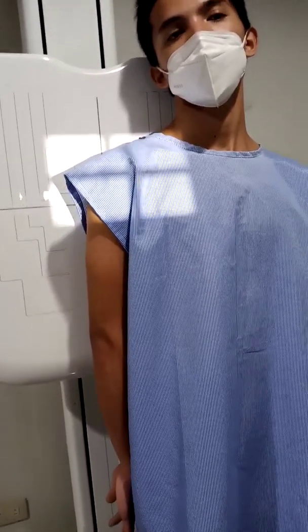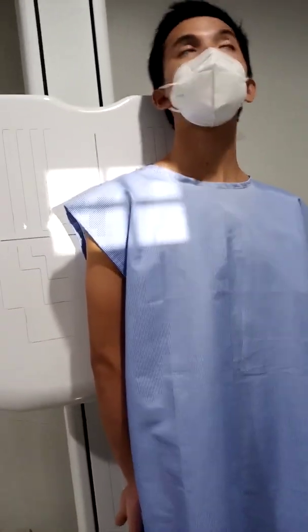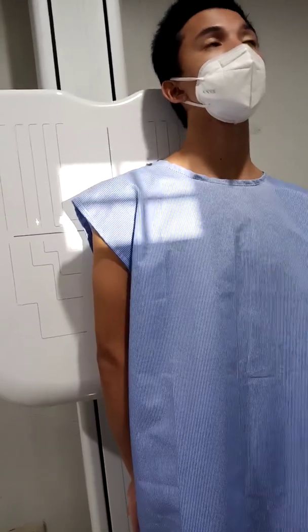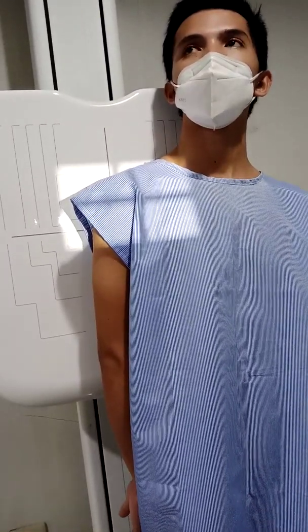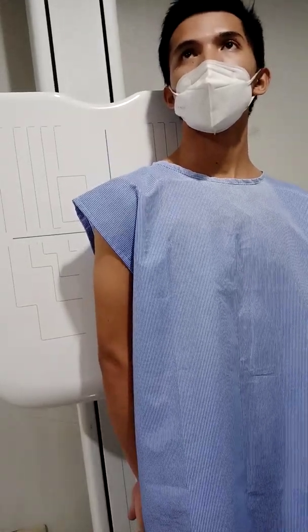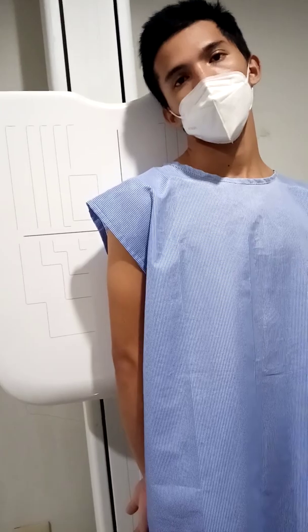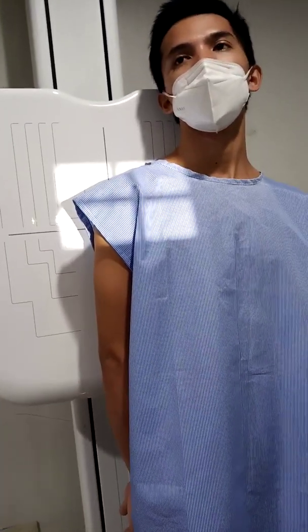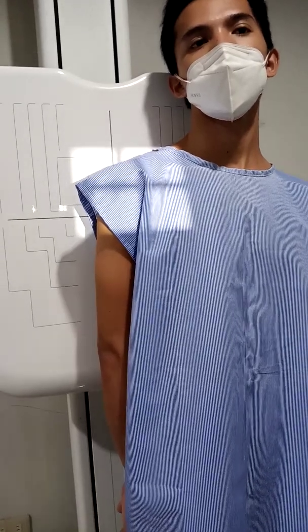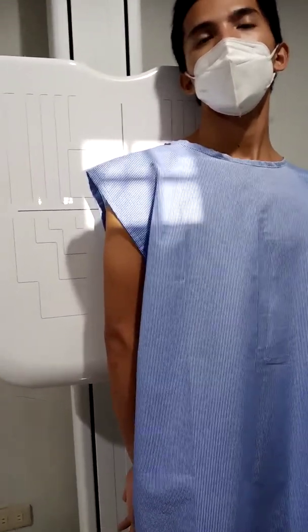to 113 centimeter. Then always remember that in collimation, collimate on the side of the shoulder, and make sure that you leave 1 inch in the collimation, to include the shoulder joint.